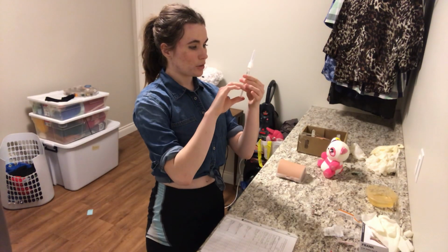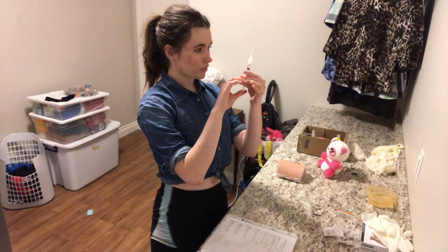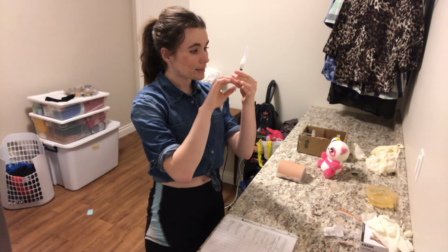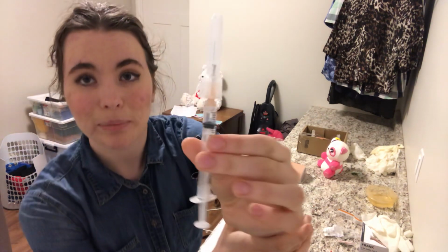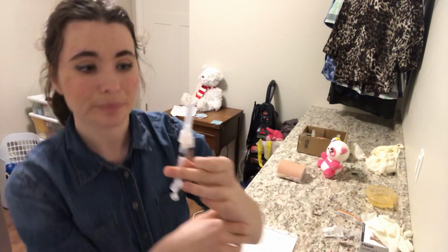And now I'm going to recalibrate my dose, and now I see that I have exactly 1/2 ml, and I have a bleb at the top, so there's no need to utilize the med waste in this case.